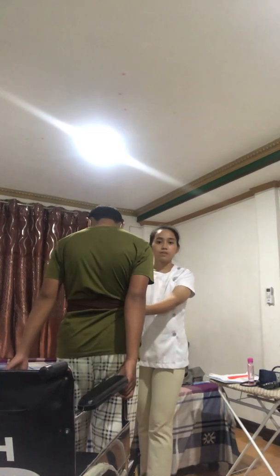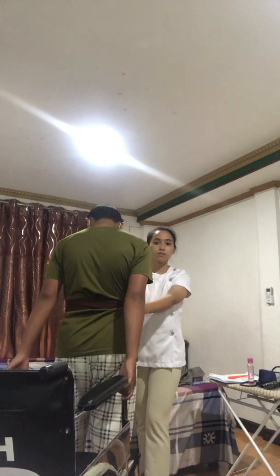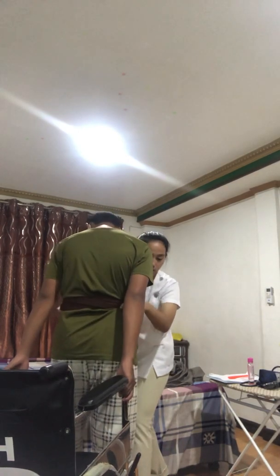Next, flex hips and knees while lowering client into wheelchair or chair. Rationale: prevents injury to client from poor body alignment. Upo lang tayo, sir, ha?